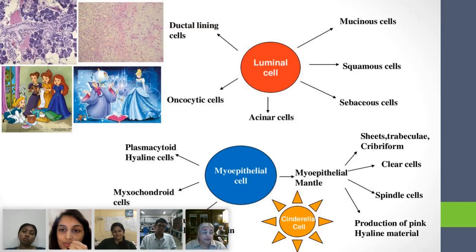So when you think of a myoepithelial cell, which you never notice, you can't notice myoepithelial cells, but under conditions of neoplasia where some wand is waved, the myoepithelial cells can transform themselves into all these huge different kinds of types, make different kinds of stromas and everything else. So we should look out for myoepithelial cells.